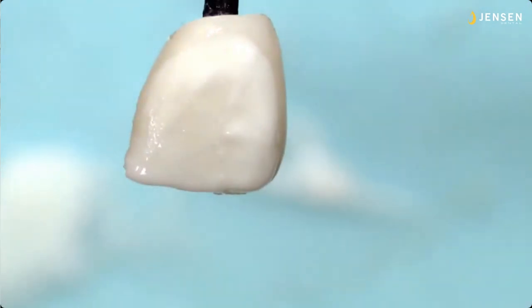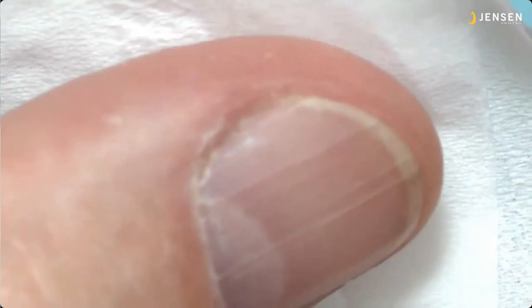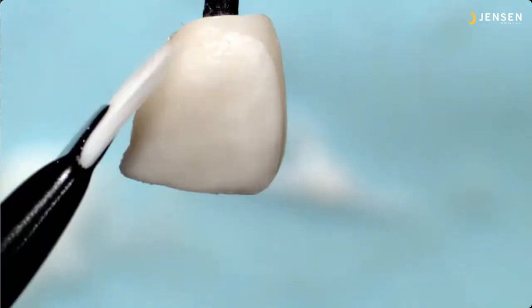This material, the structures for the teeth in the aesthetic kit, the window and the enamel, are extremely translucent. Nothing burns out. You would think some of the acrylic fibers or something would burn out. Nope. All dirt you get in there will be on display for you and the world to see if you don't get it out. So I normally use loops to check it and make sure.